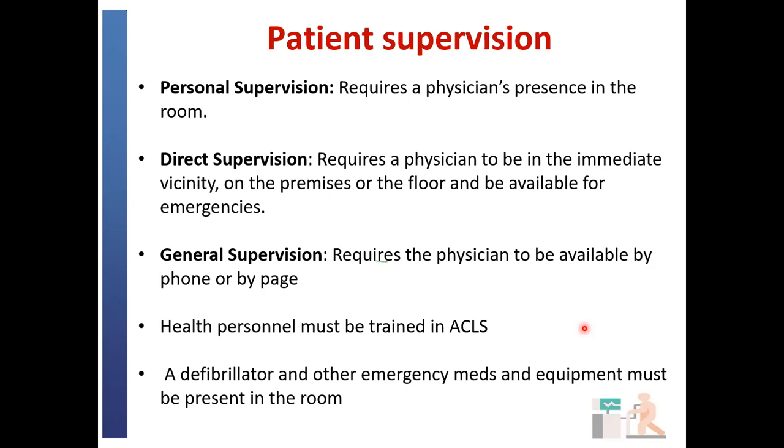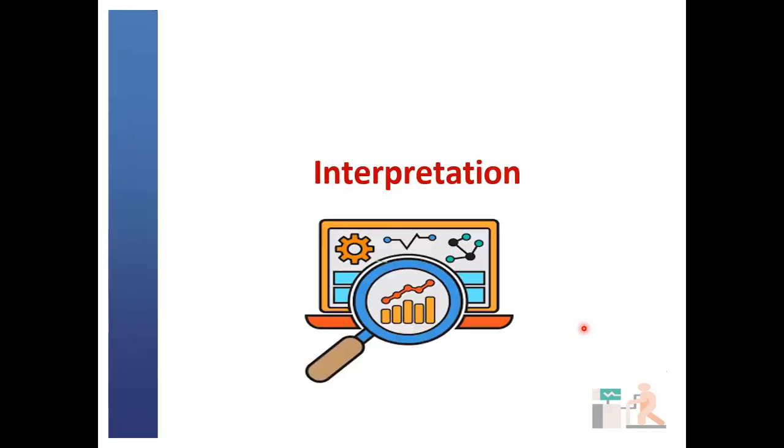Specifically, if you think the patient is high risk, of course, you will have to opt for personal supervision, where the physician is present in the room at that point, should any emergency come up, and is readily available to intervene. And the health personnel conducting the test must be trained in ACLS. Like I mentioned earlier, a defibrillator and other emergency medications and equipment must be present in the room.